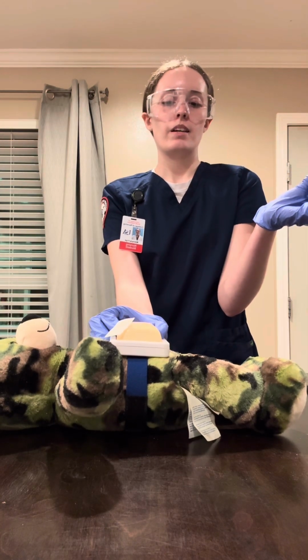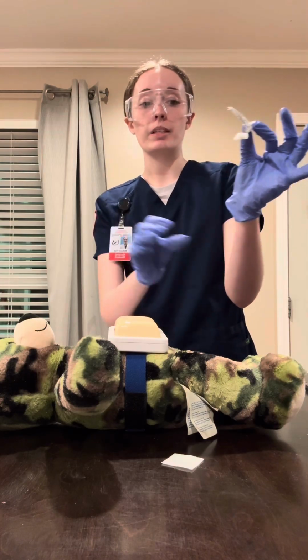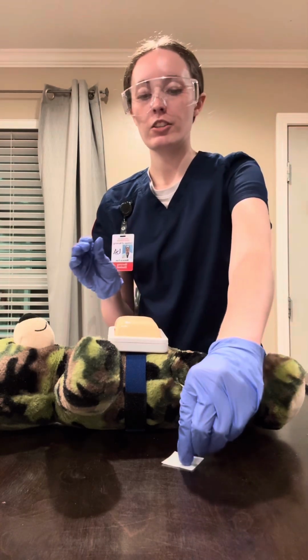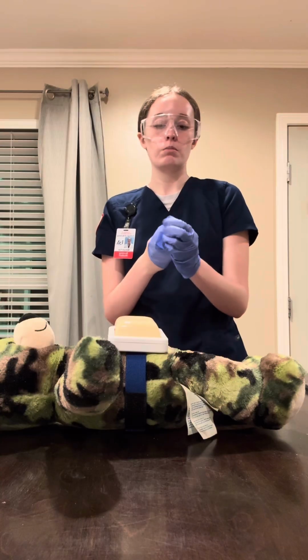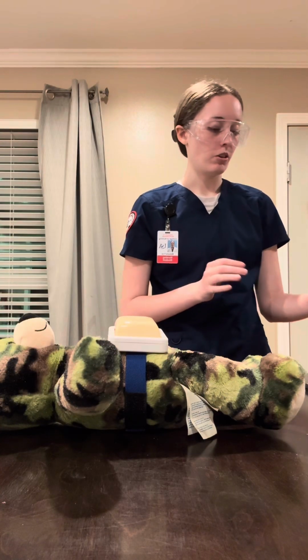All right, Mr. Jones, how do you feel like you did? I'm going to place this in my sharps container. How do you feel like you did, Mr. Jones? I feel like I did great. All right, perfect. So I'm just going to take my gloves off and throw those away. Are you feeling any pain or tenderness?